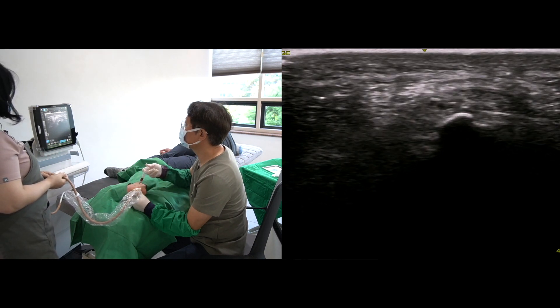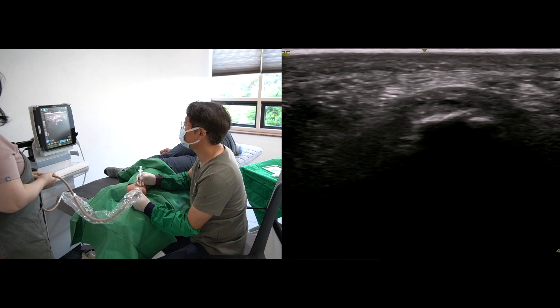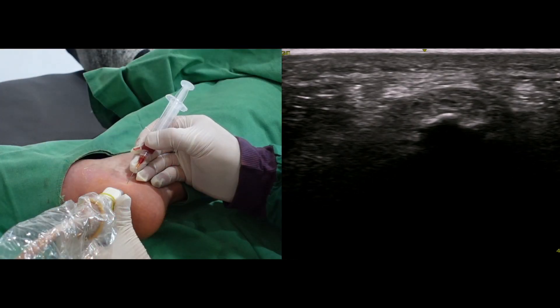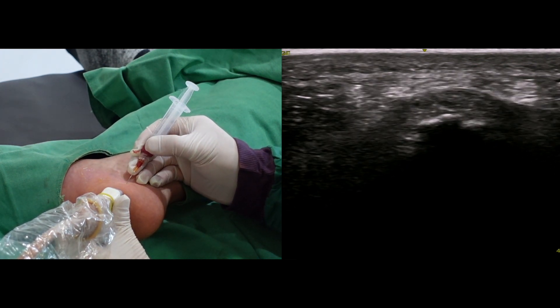Some of the injectant is spreading into the torn plantar fascia. I retrieve the needle and redirect it toward the superficial side of the plantar fascia.